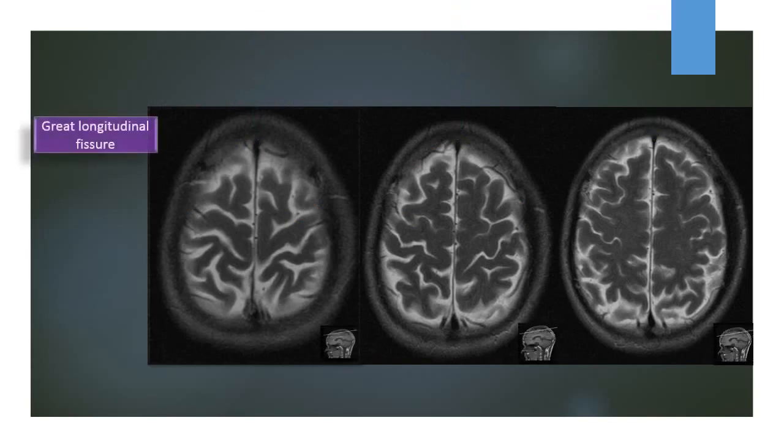This arrow indicates the great longitudinal fissure, and it is occupied by the Falx cerebri.